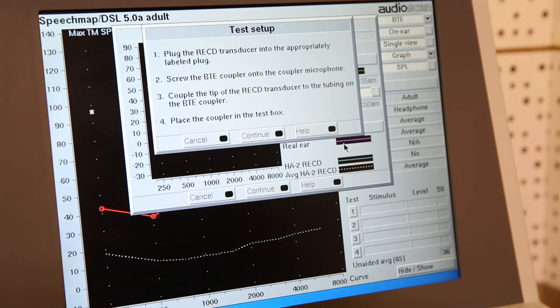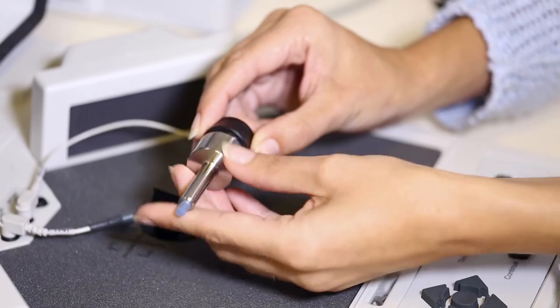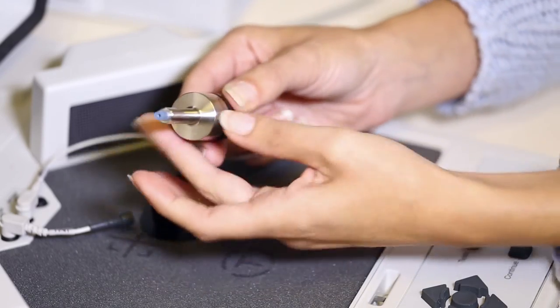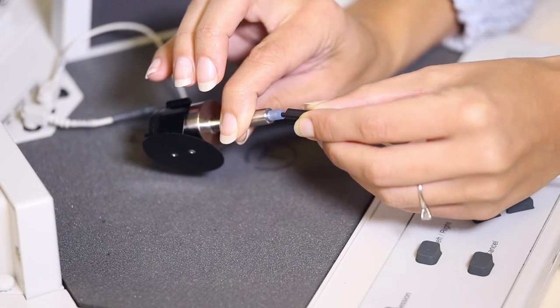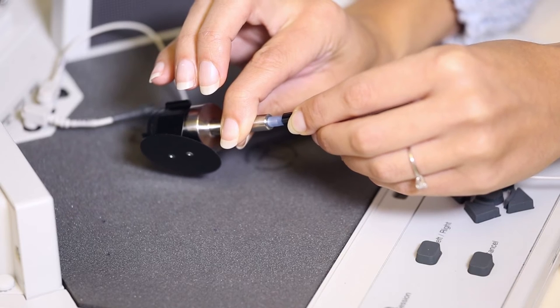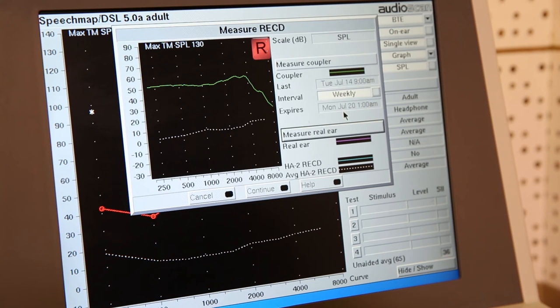Remember that RECD is not a measure of verification. The prompts on the screen show you exactly what to do. First, we test the coupler in the test box. Attach the coupler to the coupler microphone. And then attach the RECD transducer or speaker to the coupler like so. Push continue. The measurement should look like this. This shows the resonance characteristics of the 2cc coupler when a 55dB shh sound is played into it.